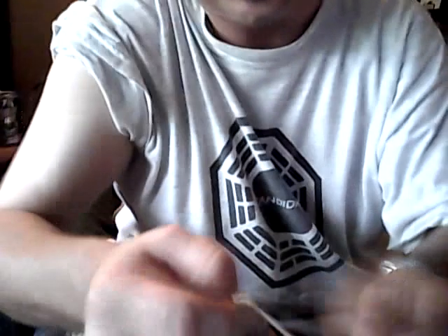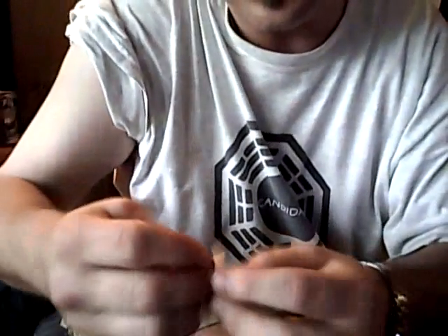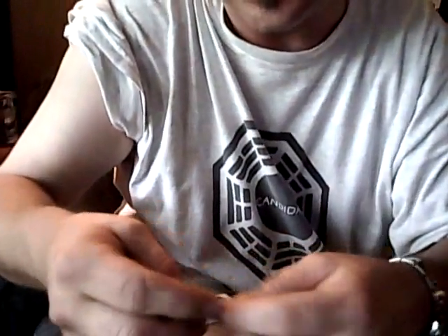It's probably not going to bleed much, but just to be safe, I usually get out a Band-Aid, because I never know when I'm going to be getting dirty on the job or around the house or whatever. So while it's still kind of fresh in my mind where it is, I'm going to stick a Band-Aid on there. And that's pretty much it. So this took me almost 9 minutes to tell you how to do it, and I did it. If I don't have to be telling you how to do it, it can take me 2 minutes, if that. So I hope that helped anybody who has to take this med.